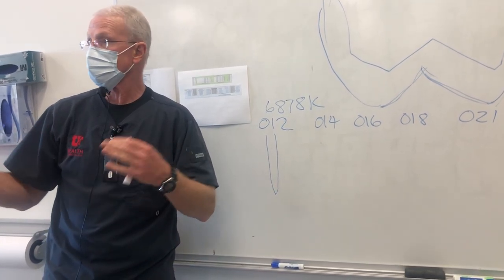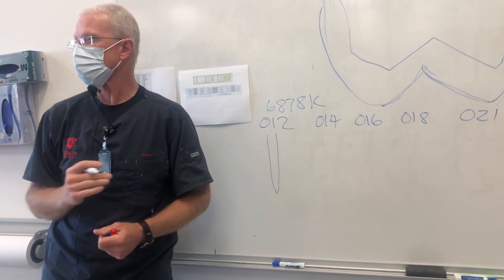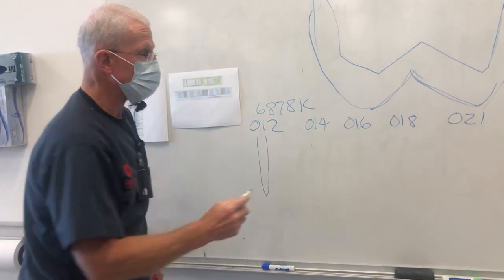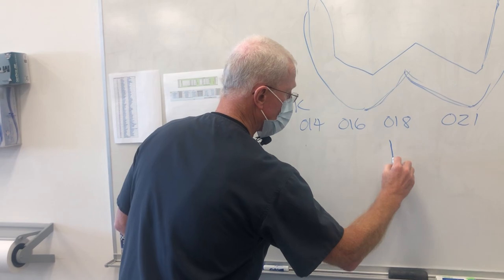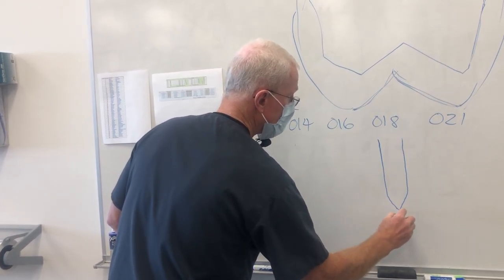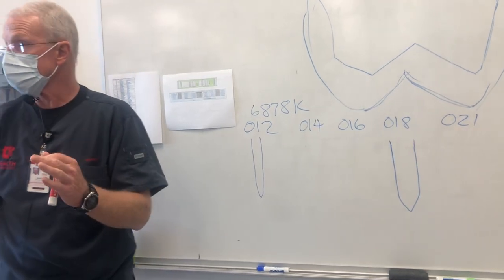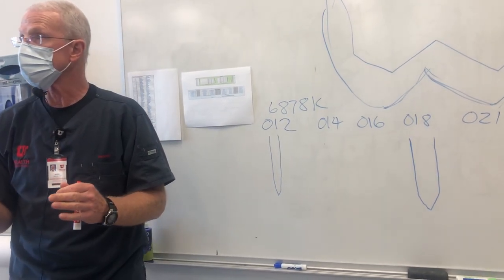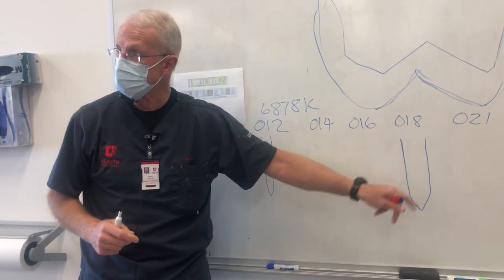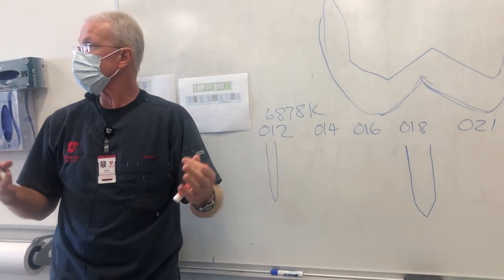You could use it buccal and lingual, but you couldn't use it interproximally in most cases. So on your burr block, we put an 018, which is big enough that it's pretty efficient. The bigger the diameter, the more efficient the burr is going to be. And so the more of the preparation that you can do with this larger diameter, the faster it's going to cut.